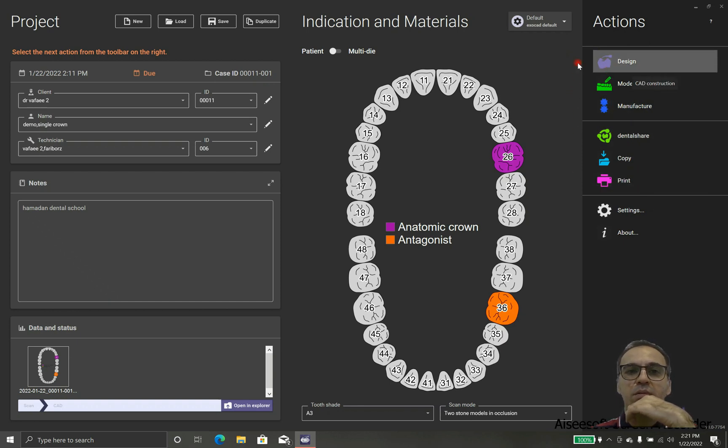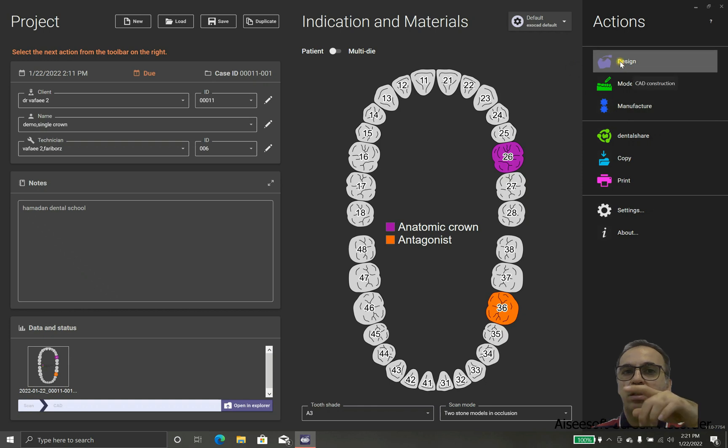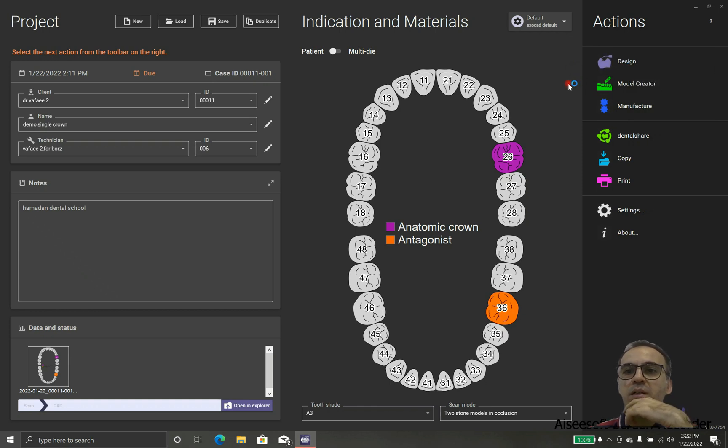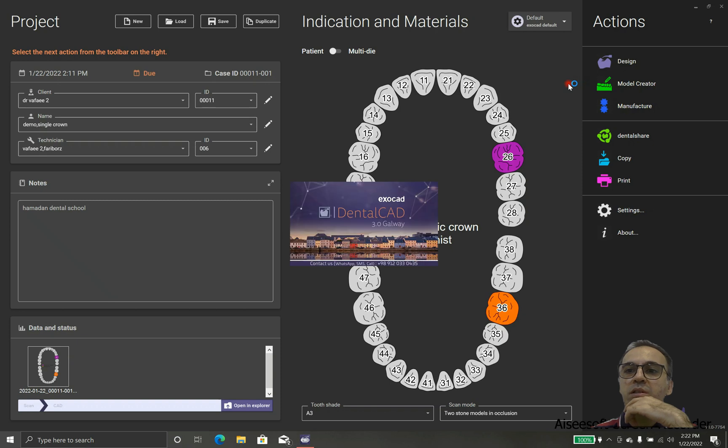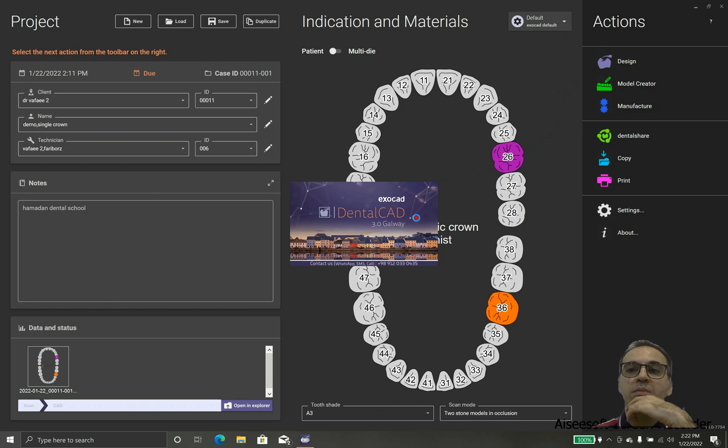We have design, model creator and manufacturer. The first thing you're going to design because we don't have any model or we are not going to manufacture right now, we didn't make anything that we could manufacture yet.